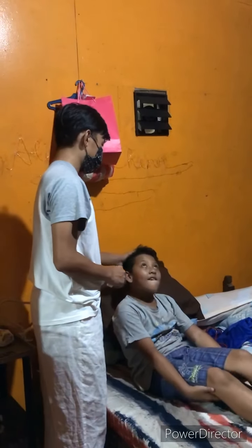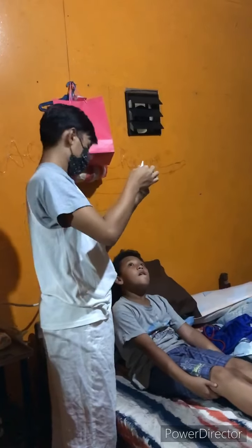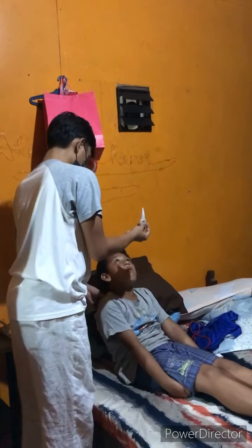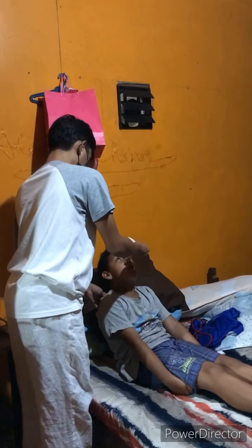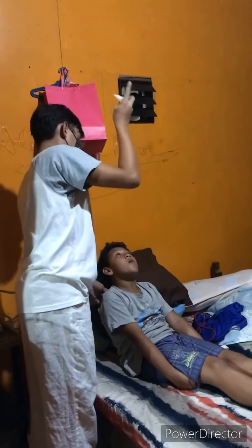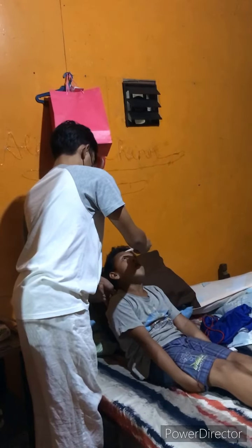Remove cap from the medication bottle, being careful not to touch the inner side of the cap. Touching the inner side of the cap may contaminate the bottle of medication. Invert the monodrip that is commonly used to instill eye drops. Have the patient look up and focus on something on the ceiling. By having the patient look up, the procedure is less traumatic and keeps the eye still.